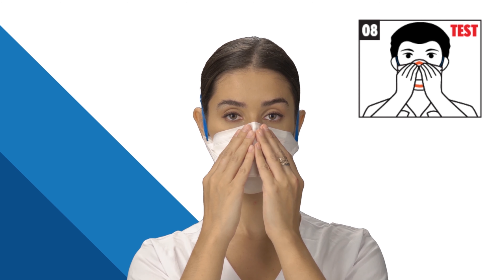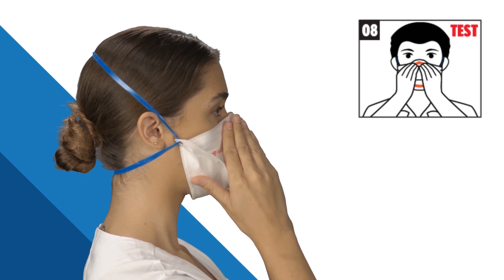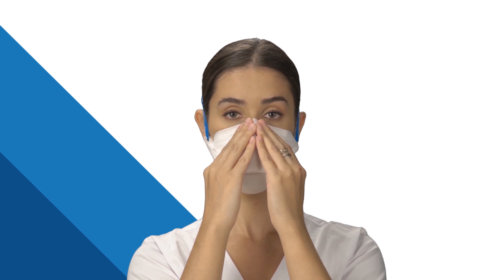Using both hands simultaneously, use your fingertips and press the foam to mold the mask tightly on your face. For best fitting, start from the top of your nose through both sides of the nose and the cheeks. This is important to ensure an adequate seal between the mask and face around the nose.